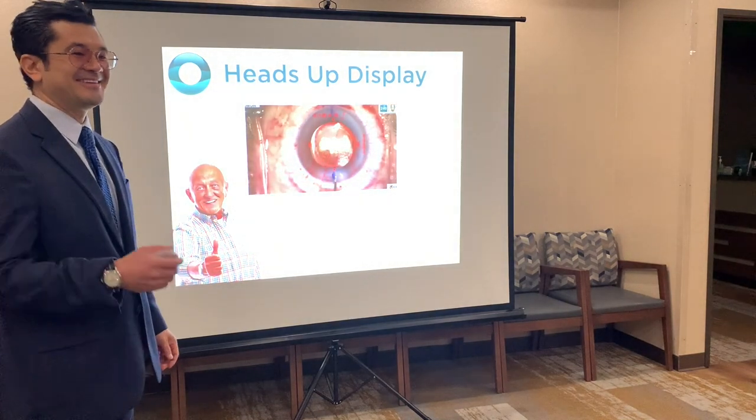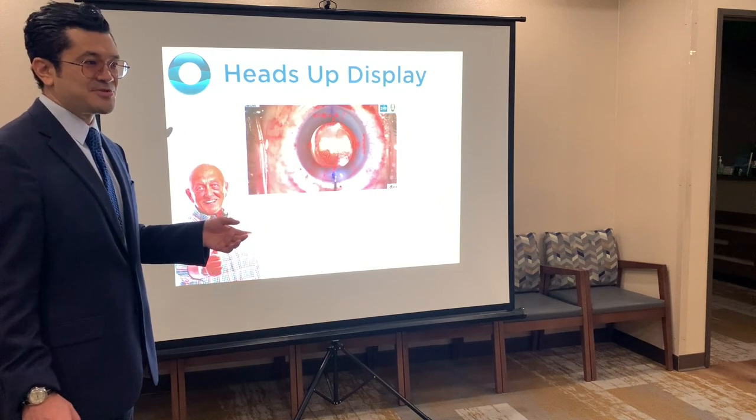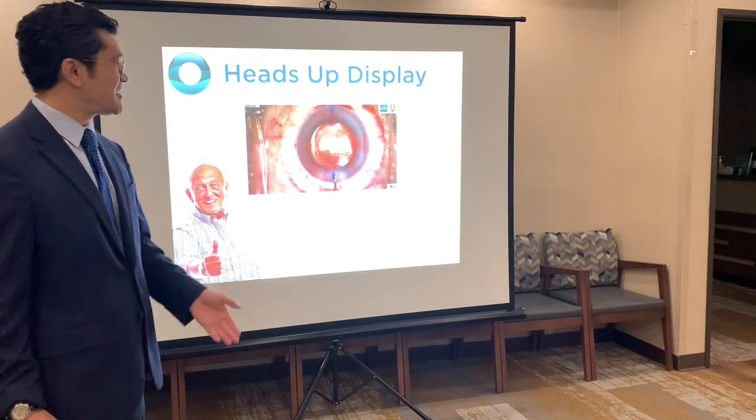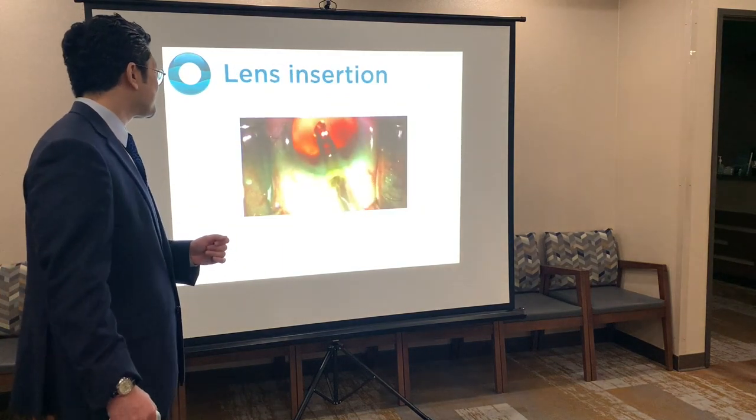Questions on ORA? So I think for anyone that wants a little more precision for surgery or has maybe a history of LASIK, definitely ORA is really good to have.